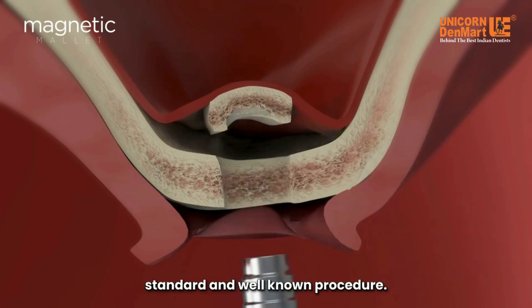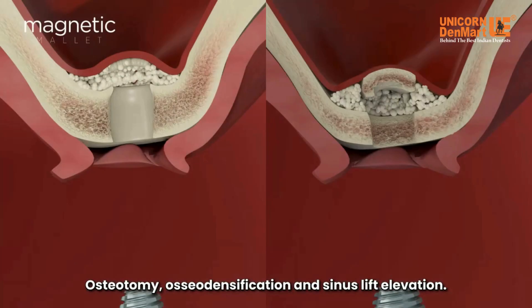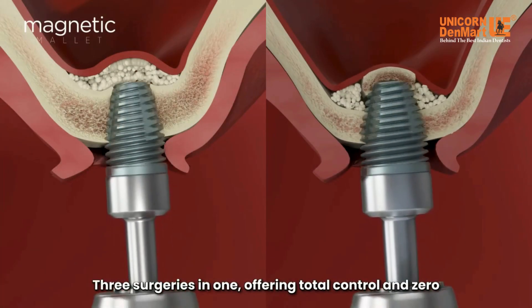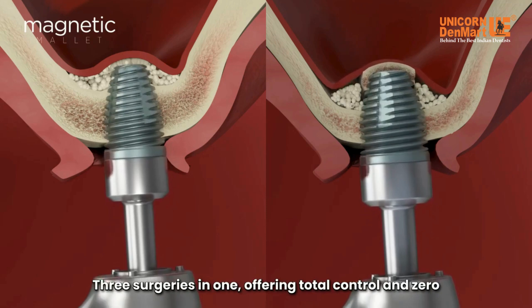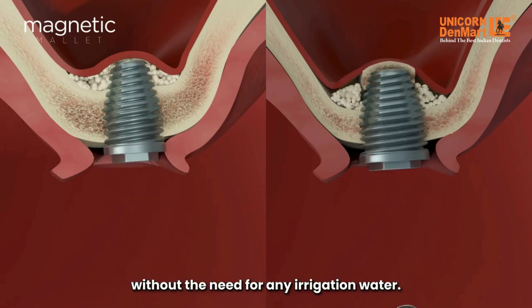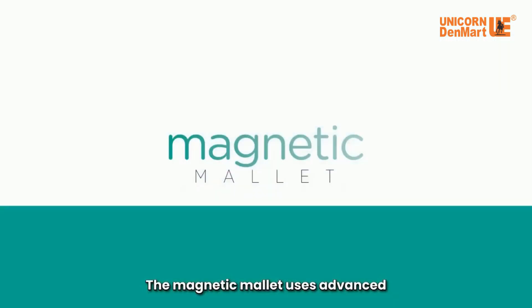Osteotomy, osseo densification, and sinus lift elevation — three surgeries in one — offering total control and zero bone loss, without increasing the bone temperature and therefore without the need for any irrigation water.